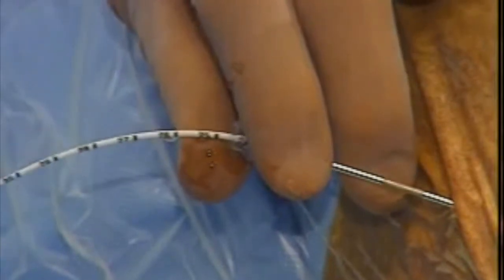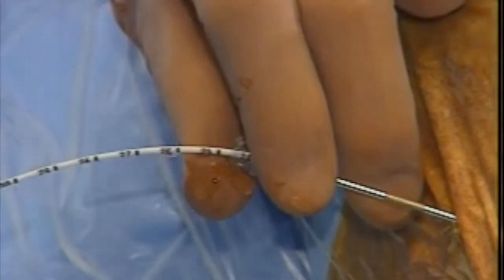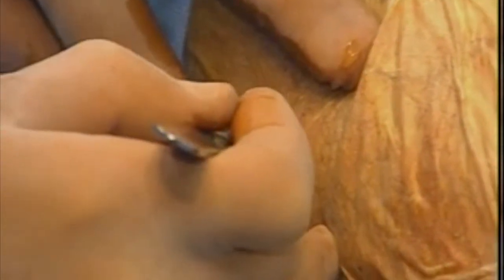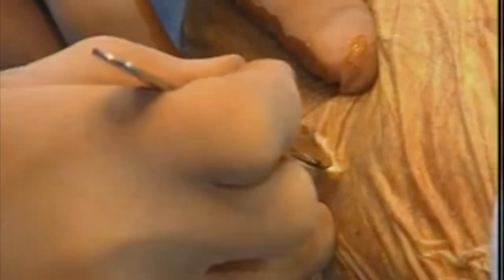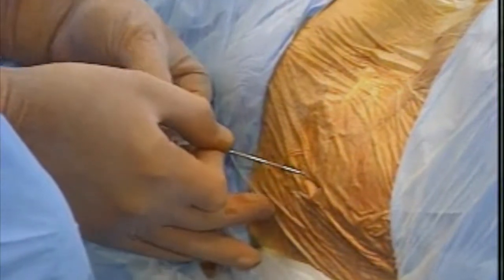The centimeter markings on the catheter can also be used to determine the length of the catheter in the spinal canal. With the needle still in place to protect the catheter, make a linear or curved incision that exposes the lumbodorsal fascia. The incision should be long enough to permit placement of the catheter anchors without introducing kinks or sharp bends into the system. Carefully remove the needle from the fascia.